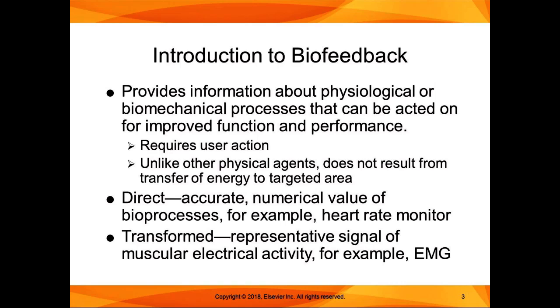So the electromyographic biofeedback is an example of this. There are lots of things that we do that are, strictly speaking, biofeedback that are not the EMG biofeedback.